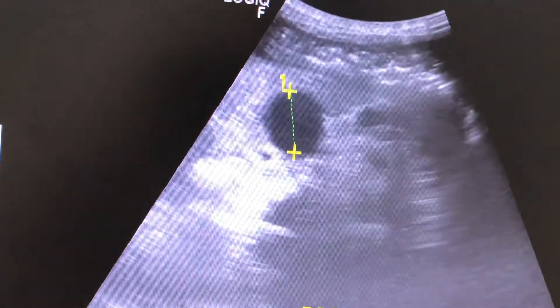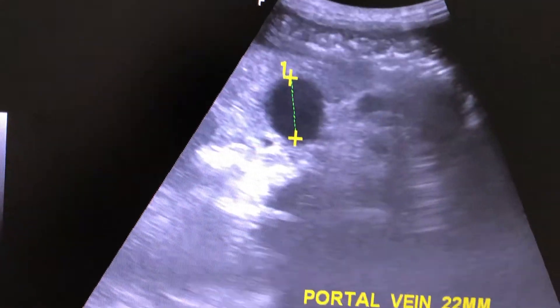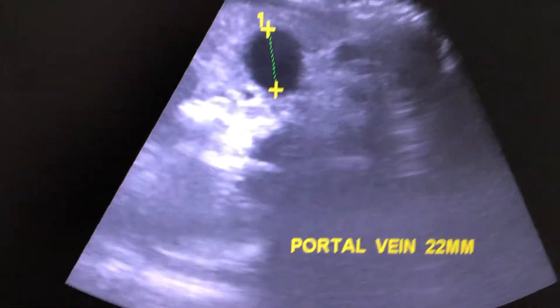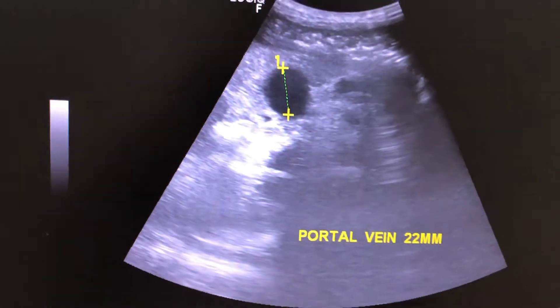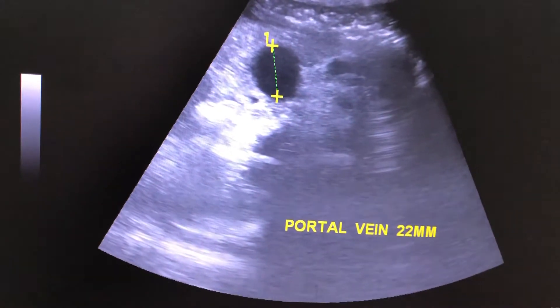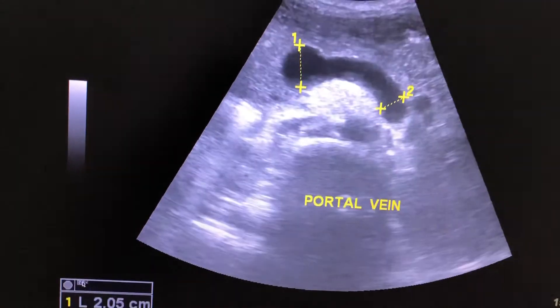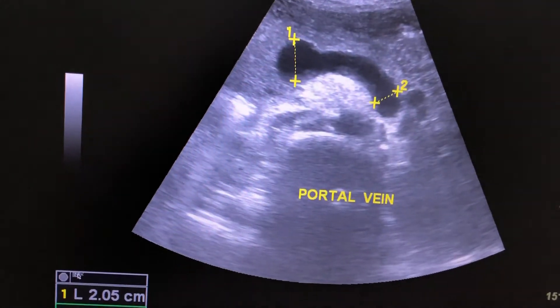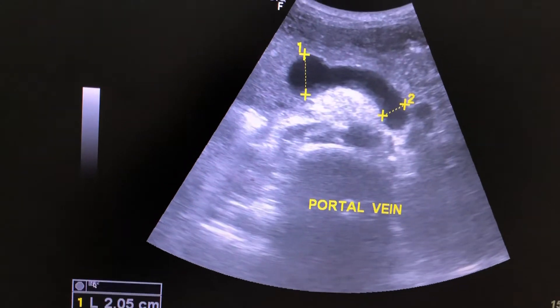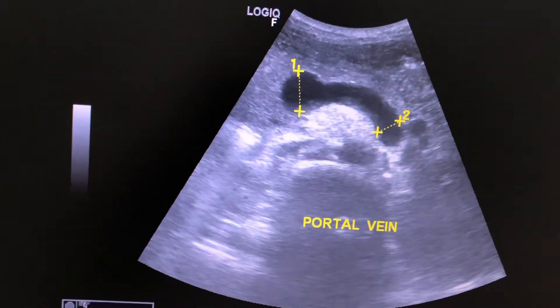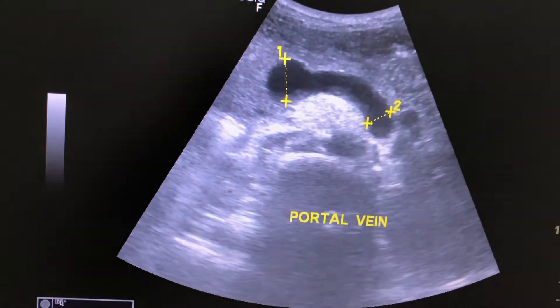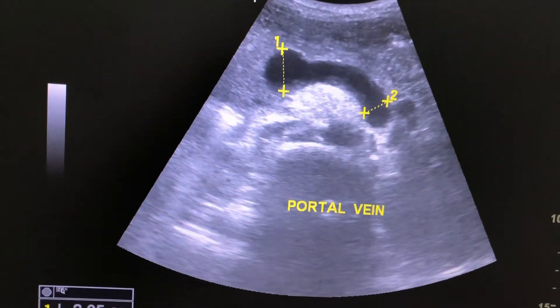This is the portal vein measuring at the pancreatic head, measuring 22 mm. This is the transverse view of the portal vein.